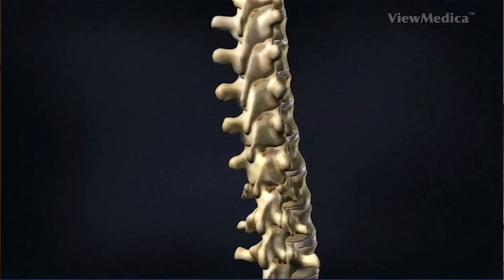This diagnostic procedure is performed to identify a painful facet joint. The facet joints are the joints between the vertebra and the spine. They allow the spine to bend, flex, and twist.